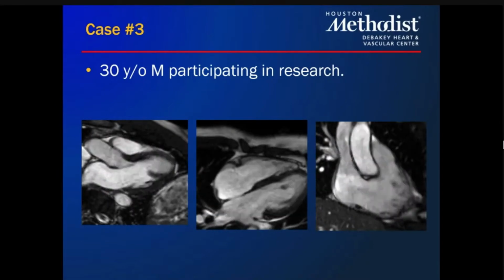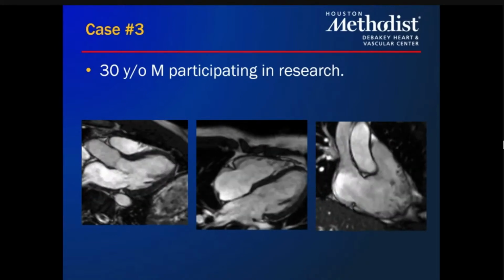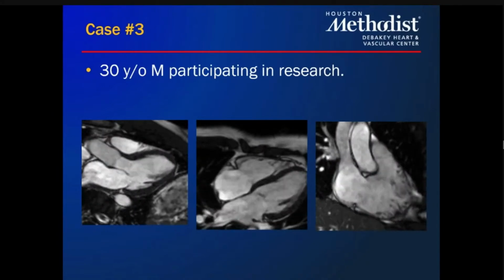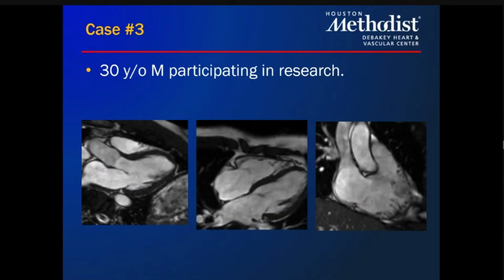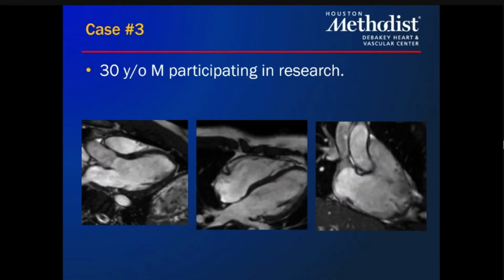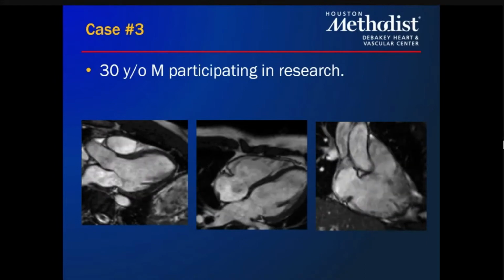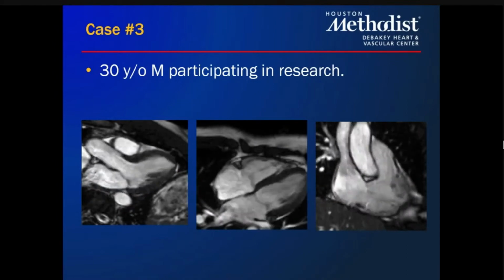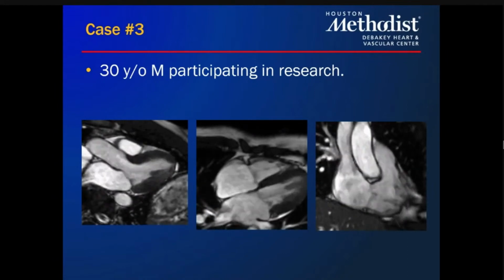Yeah, so this particular volunteer was like you, George. He works out a lot, actually does a lot of running, cardio, and absolutely his heart rates were in the 50s. The chambers did come out dilated, but everything came out normal function, no issues whatsoever. But this comes up again and again as to whether or not we're dealing with someone with a pathologic enlargement of the different chamber sizes, right ventricle and RA included. And so these patients show up in our CMR lab, and we go through all this, look at their clinical history, and have to comment on whether or not we're dealing with an athlete's heart or not.